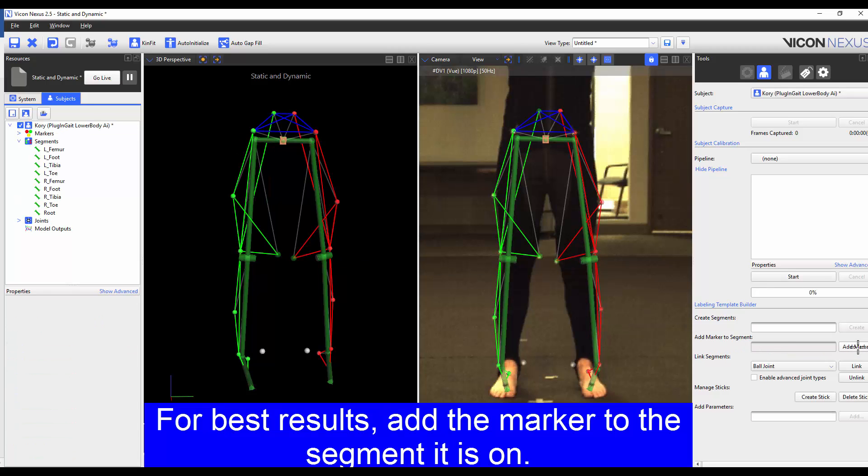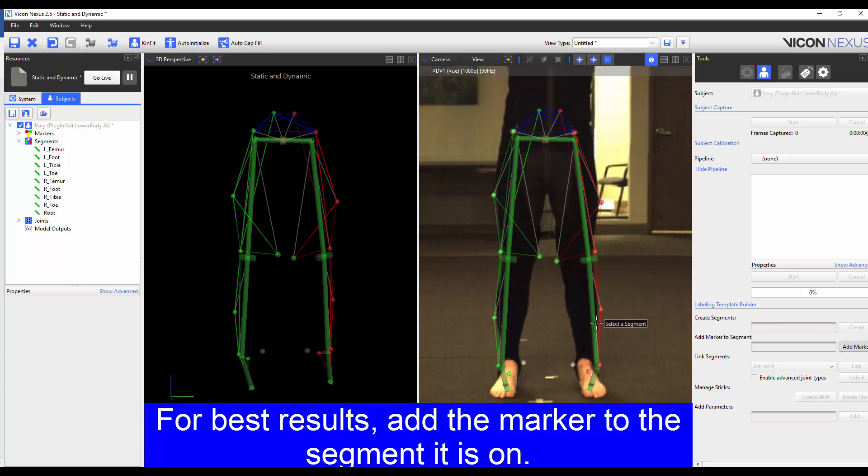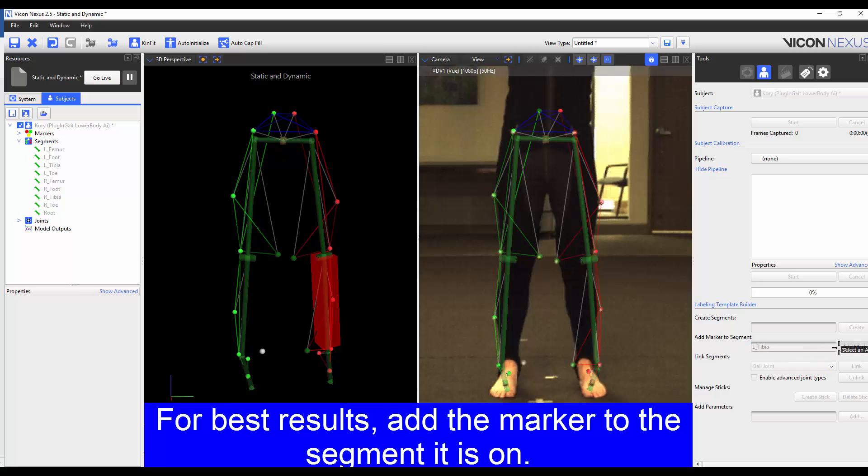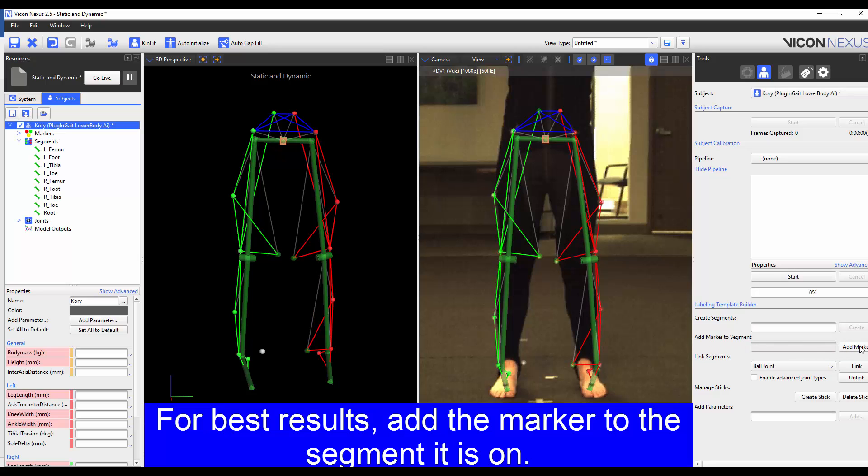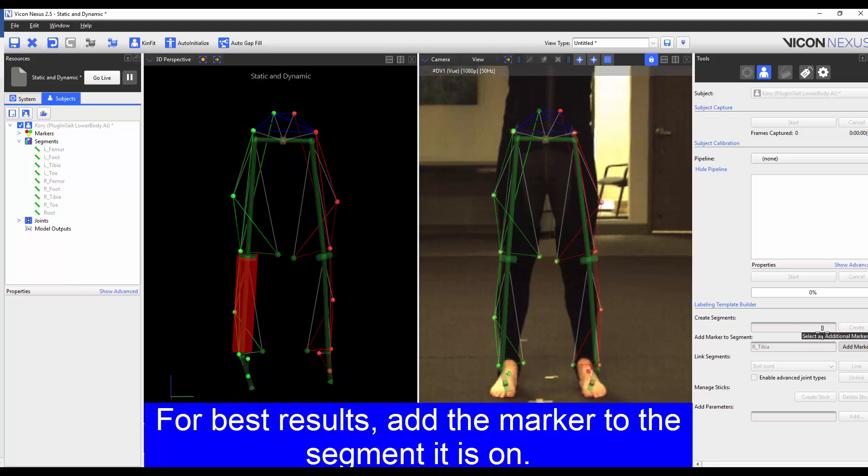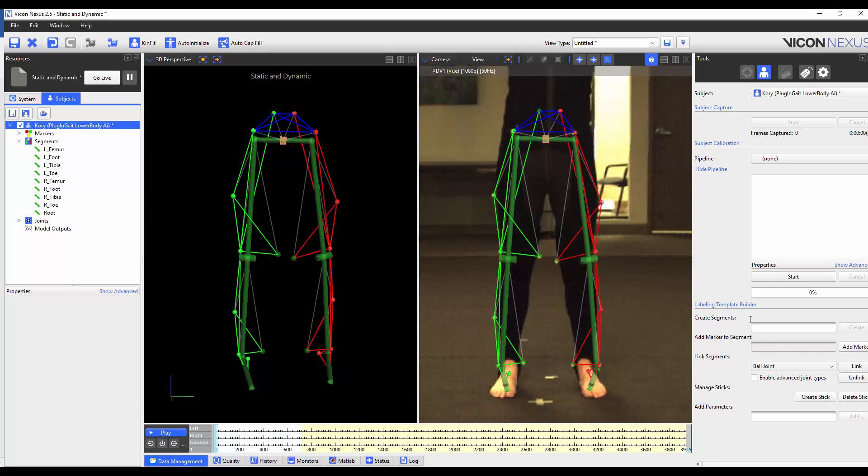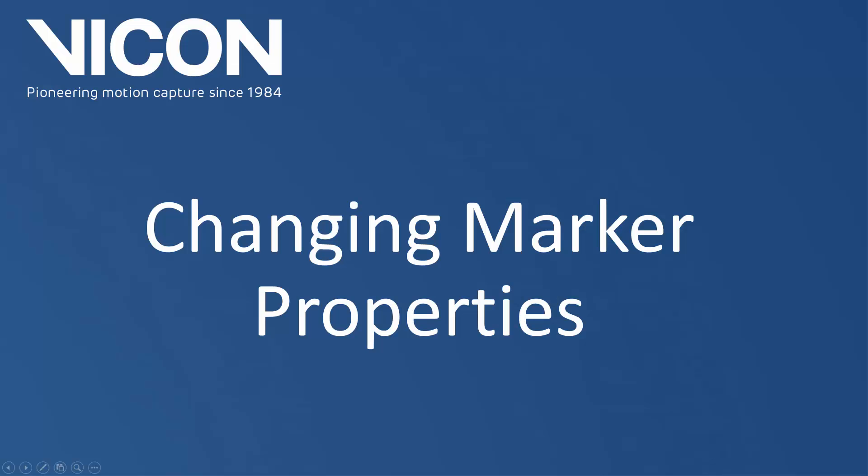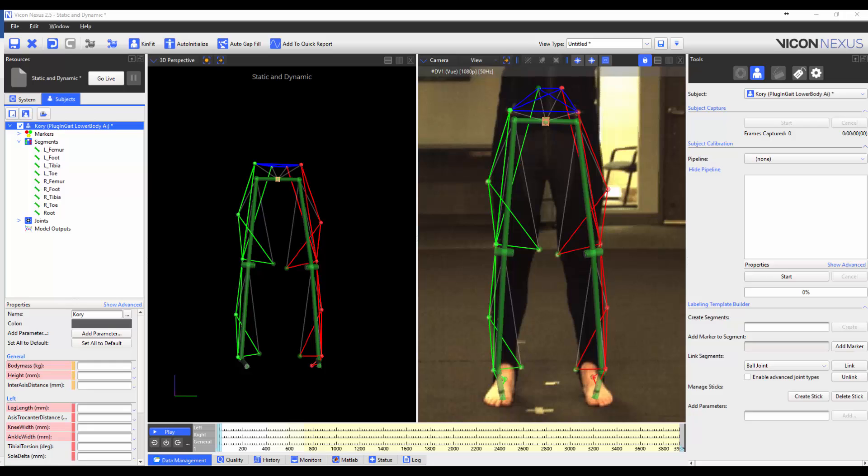I'm going to repeat the process for the remaining markers. Now that I've added the extra markers, we can see them in the markers list.